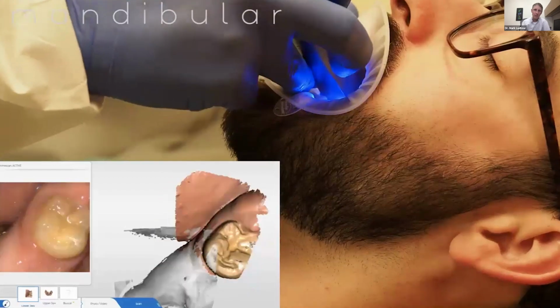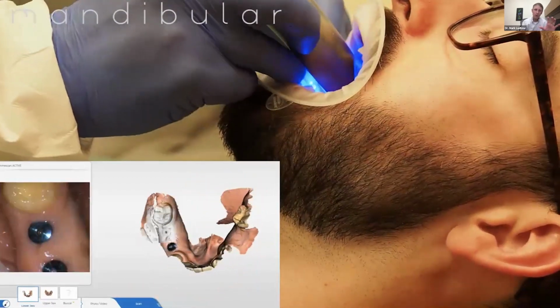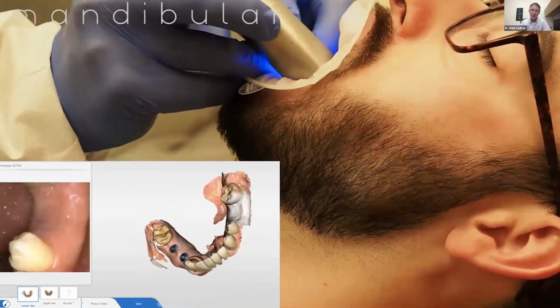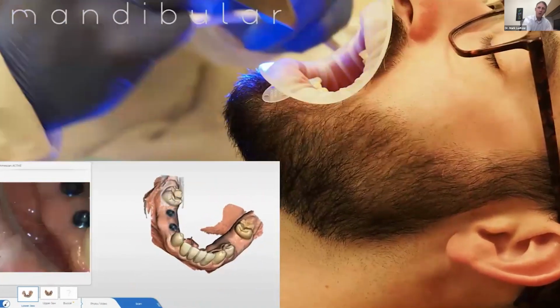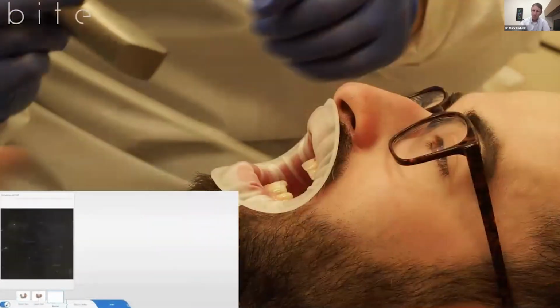So again, here's the lingual. Coming back, we'll go occlusally with a little bit of facial bias. And now watch it coming through the front and just rolling across the front like that and going back. That little trick can really help you from having to pick the scanner up, turn it 180 degrees, and go back the other way.